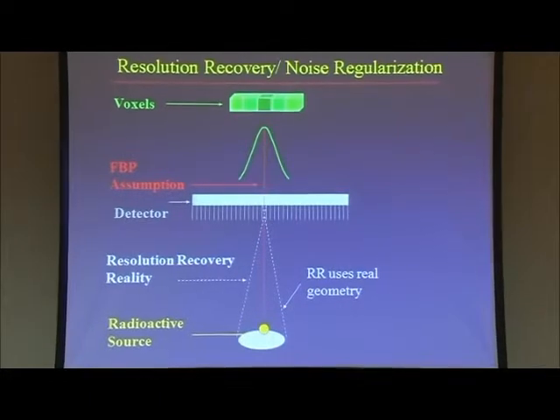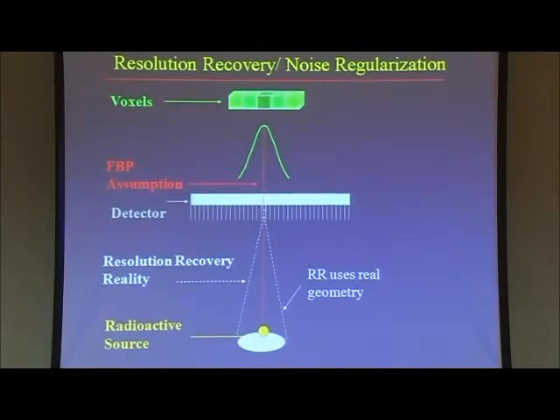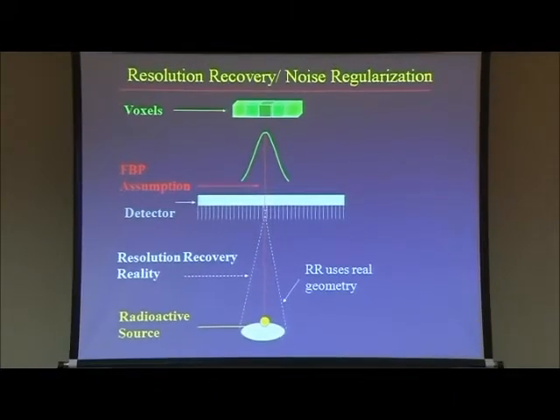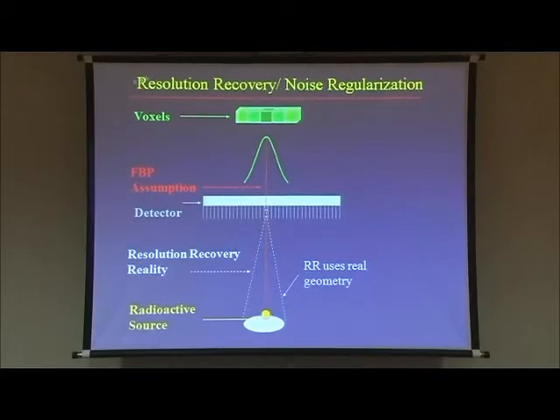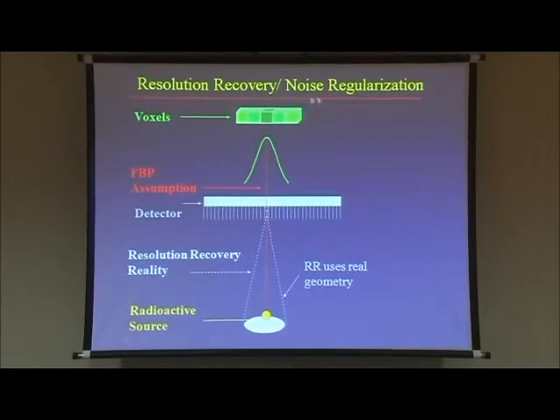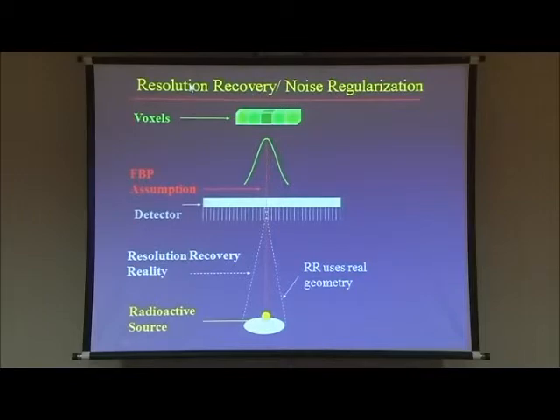because all these new machines have new reconstruction techniques. Let's talk about two concepts: resolution recovery and noise regularization. You might think of noise regularization as filtering, and resolution recovery as depth-dependent resolution correction. And it's true, that's what they help with.